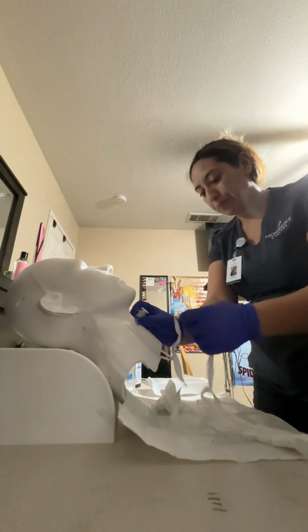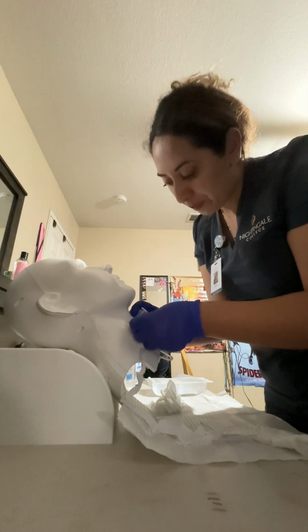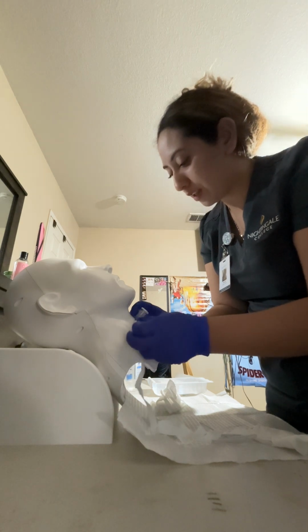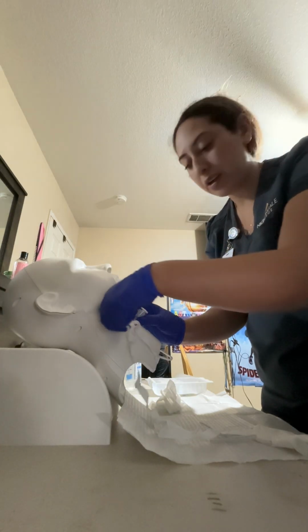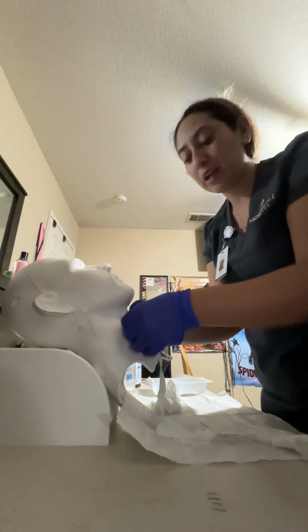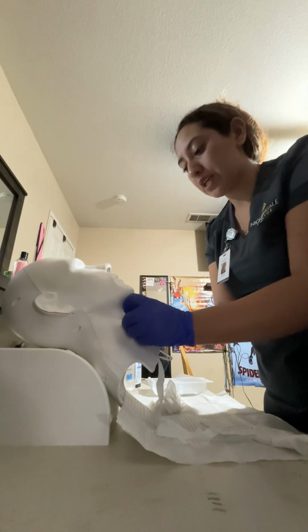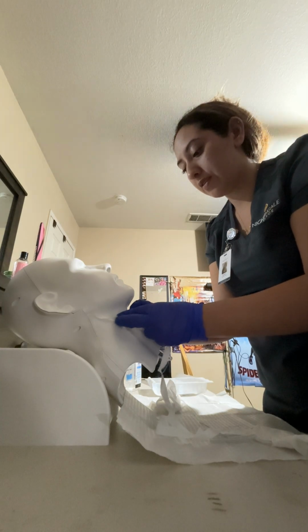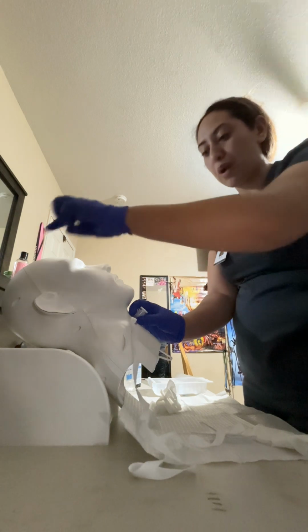I will, at this time, reapply his trach ties. And I am going to assure that when I tie this, I leave no more than about 2 finger space here. That's to make sure that we have the trach ties tight enough that it won't dislodge, but also loose enough that it doesn't cause the patient any skin integrity issues or skin breakdown. Okay, so I have tied a knot here on the tracheostomy and we will wrap this around.